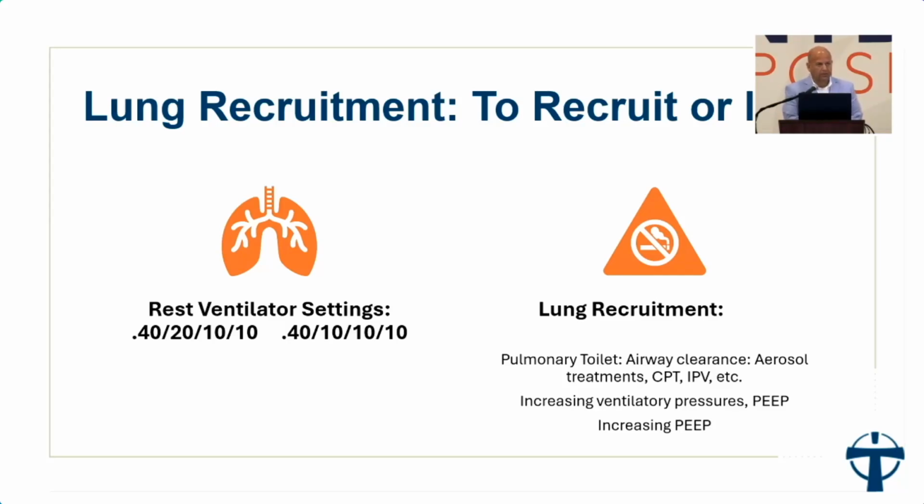I'm going to get on my soapbox for a minute, but I think a lot of programs we talk to forget to let ECMO do its job, right? Let the lungs rest, especially if it's a pulmonary issue. If it takes 2 weeks to open up the lungs, it's okay. I just find people try to rush that.